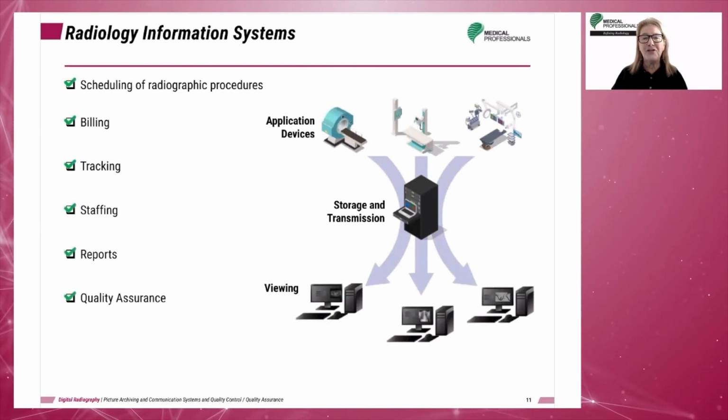The Radiology Information System, or RIS, houses radiology information and is responsible for radiology functions, such as the scheduling of patient procedures, radiology billing, radiologist-dictated reports, and quality assurance data. The system communicates with the Hospital Information System, or HIS, for shared functions.